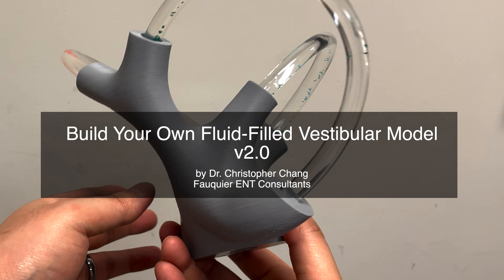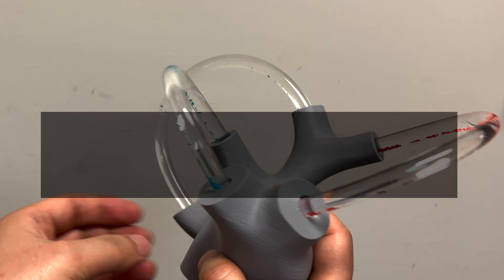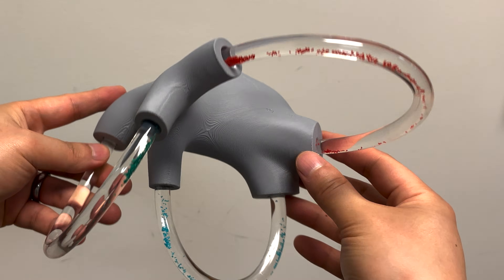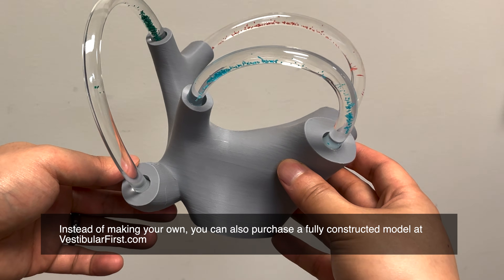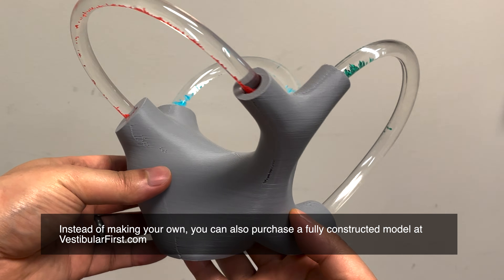The folks at Vestibular First have provided instructions on how to make your very own fluid-filled vestibular model. This model is enlarged but anatomically accurate, and allows patients as well as healthcare providers to better understand the semicircular canal fluid dynamics as well as how inner ear crystals respond to gravity when displaced in the canals.